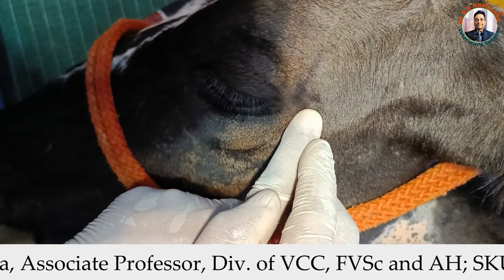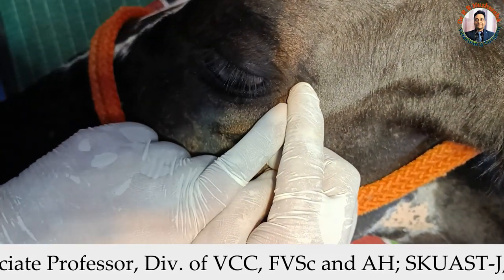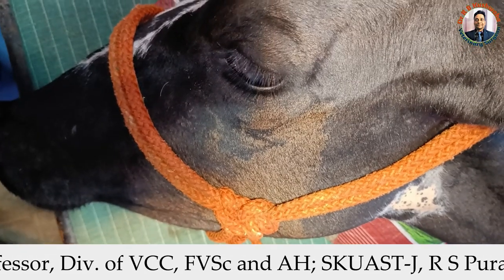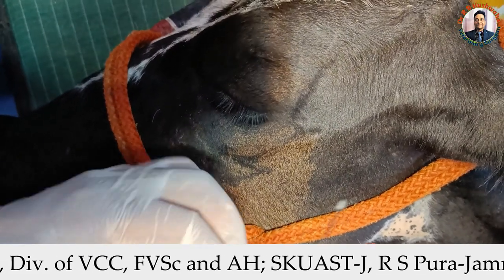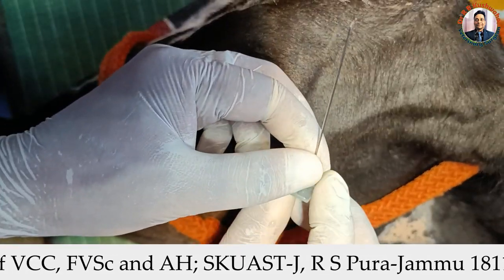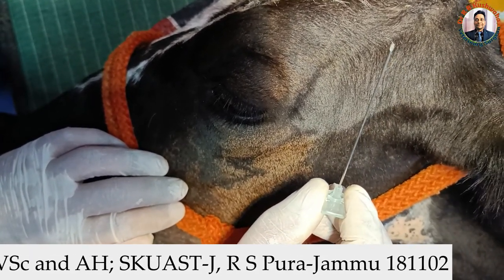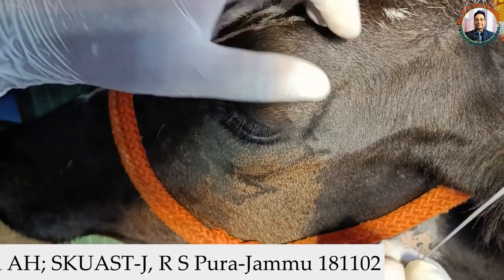If you insert the needle straight, it will strike the coronoid process of the mandible. We use a 10 cm long spinal needle. Since we don't have the appropriate size, we are using the stylet of an 18-gauge IV cannula, which is a very good alternative to a spinal needle and is also narrow.